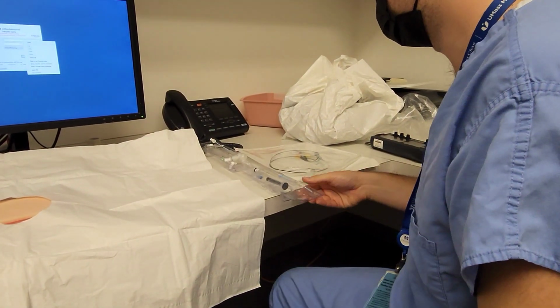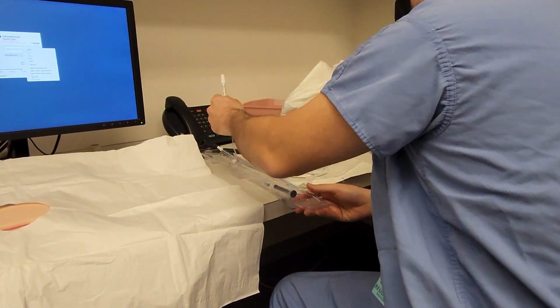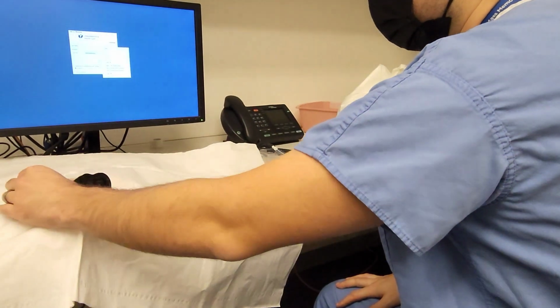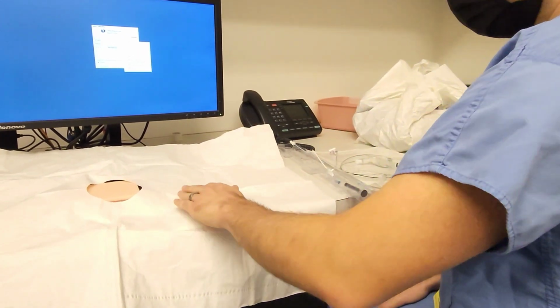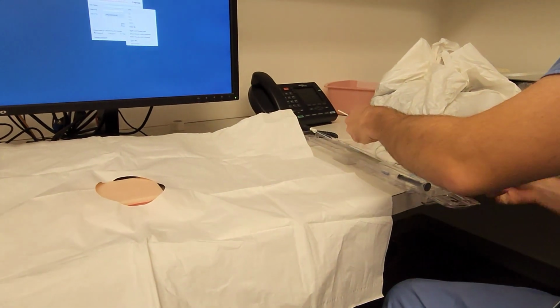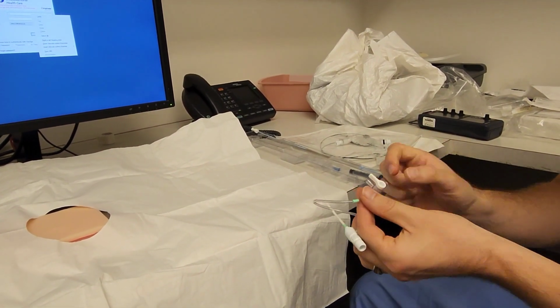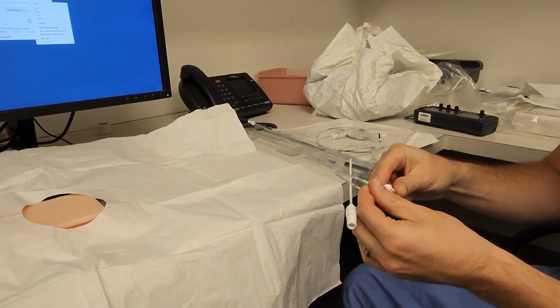So first thing is to insert the introducer sheath. It's done the same as a cordis, so you're going to be using most likely the right internal jugular. You'll drape, prep the patient with ChloraPrep, and for this you need to flush the introducer first. So you'll flush, you'll put luer locks on either end of the stopcock here.